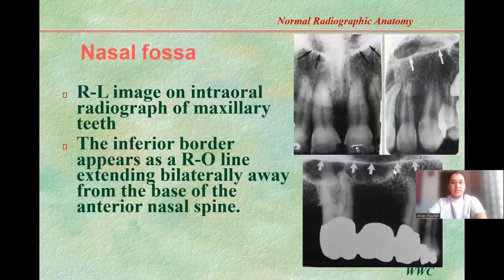We'll come to the next, the nasal fossa. Before you start reading my slides, just think, what are we talking about? Nasal fossa. What is fossa? Fossa is any depression. Okay, nasal is nose. Nose के पास जो depression है, that is nasal fossa. कौन सा depression हमारे यहाँ पे? Remember your maxilla? Maxilla आपको याद है? First diagram. There's a hollow cavity here as a triangular. That is a nasal fossa.